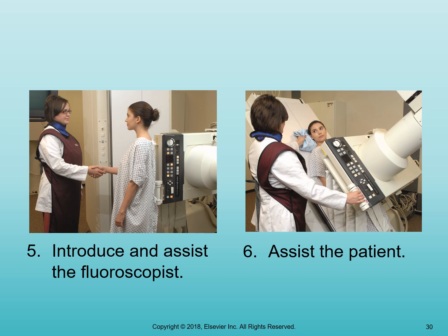So based on that, we have to do what is called a scout image. And that scout image is simply, for this procedure, an AP supine abdomen based on your patient's body habitus. You would either do a T-shot or 2 IRs placed landscape.